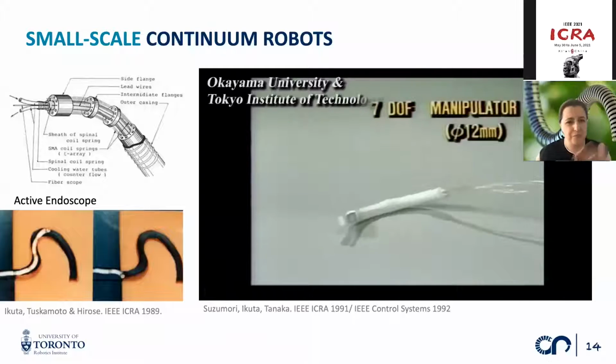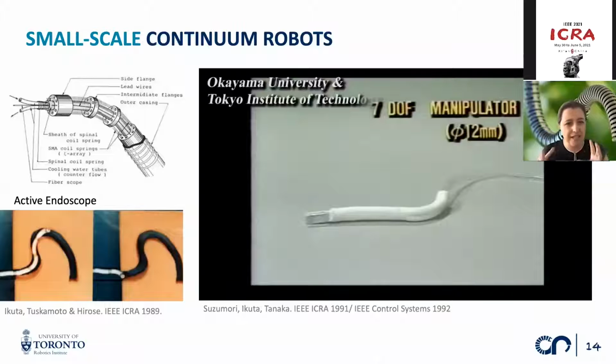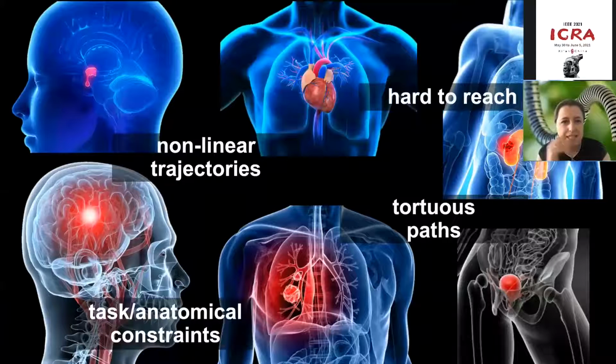And with continuum robots becoming smaller in terms of their size and diameter, what became really apparent is that there may be a significant benefit over serial robot arms or industrial-style robots in medicine. It was around the same time in the mid-80s when industrial robot arms were also explored for surgical robotics. The Puma robot arm itself was used in a neurosurgical example, which really pretty much kicked off surgical robotics.